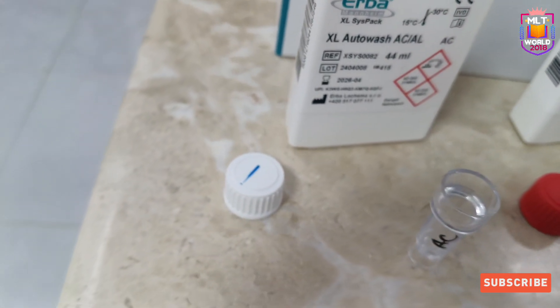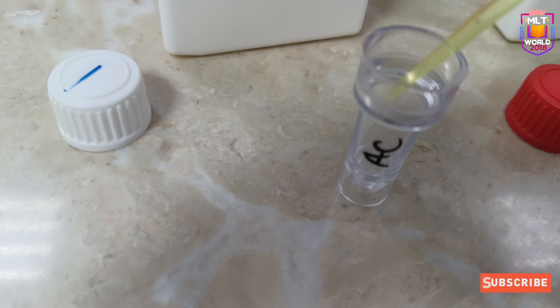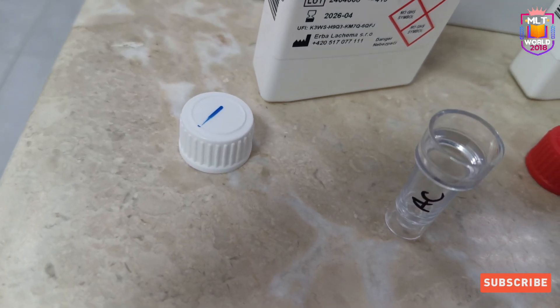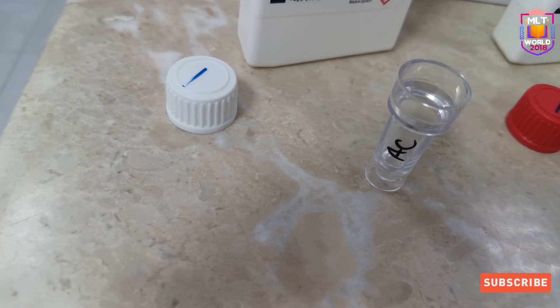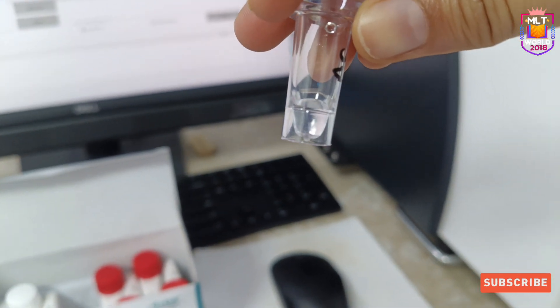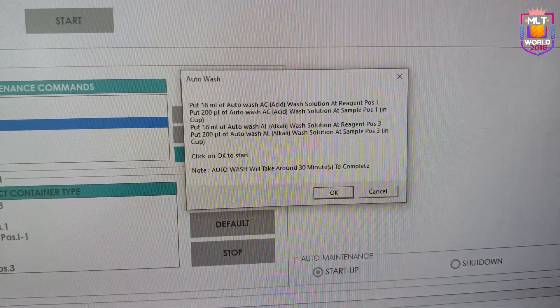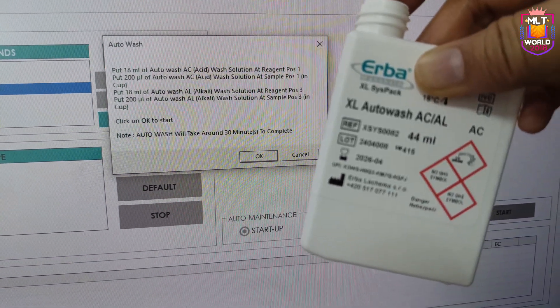First we will keep AC solution, because it was specified that AC solution needs to be at sample position 1 — 200 microlitres — and 18 ml of AC solution needs to be kept at position 1 in the reagent tray. It will use almost all 200 microlitres, but you can keep 250 microlitres if you prefer. Now we will place the 18 ml AC solution at position 1 in the reagent tray.